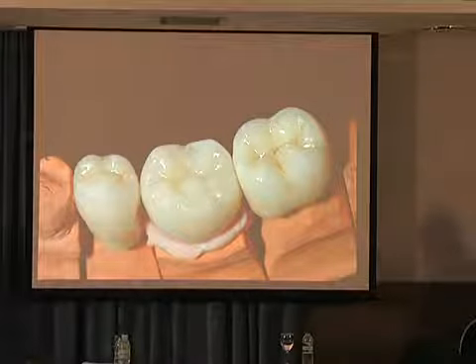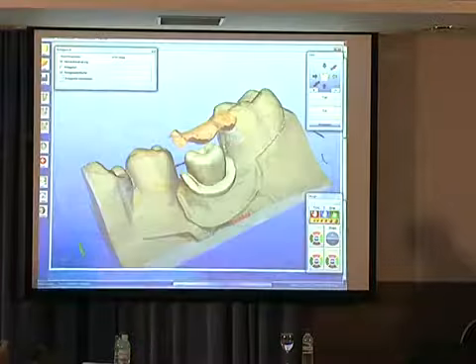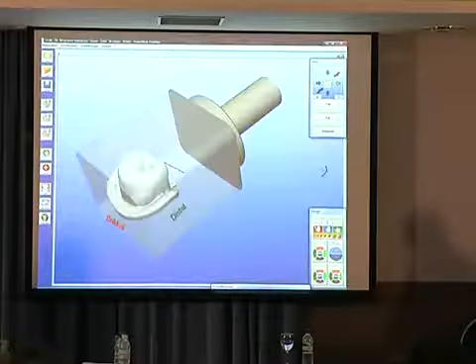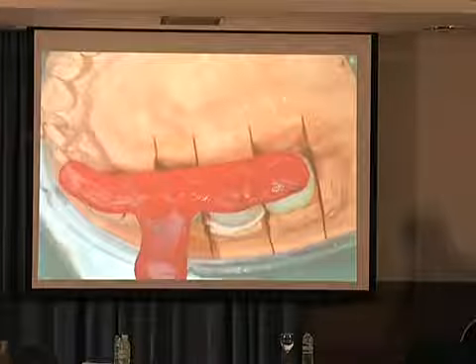The CAD-CAM all ceramic crown. This is the computer work. Milled in the computer.